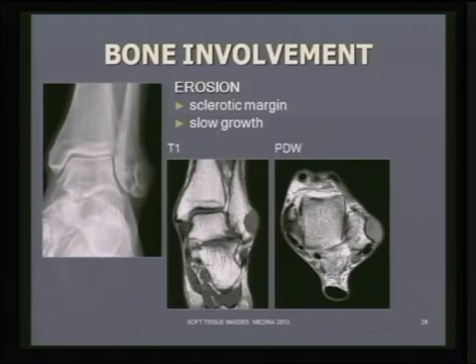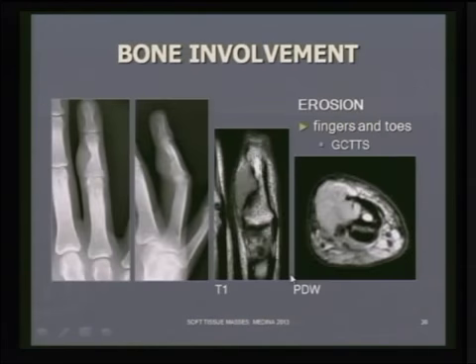What do you expect to see with a slowly growing soft tissue mass on plain film and sometimes on other imaging techniques such as MR and CT is that the lesion will have caused a chronic scalloping of the outer cortex and commonly has a sclerotic margin to it, as we can see here in the lateral malleolus, a soft tissue mass causing very chronic scalloping of the bone. And that's appreciated on the axial PD weighted images as this black line here. So this is a chronic lesion, likely to be benign because of the long-standing nature of the radiographic finding.